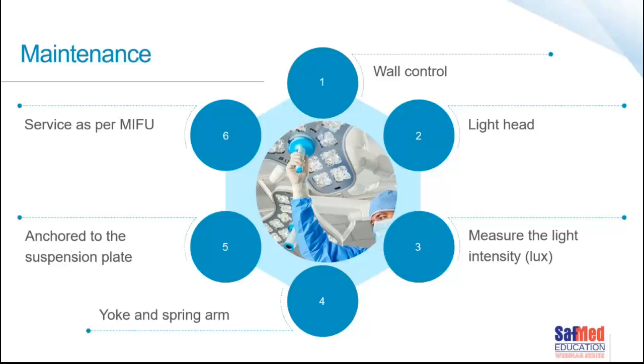So our technical department were chatting to me a little bit about maintenance and what they would do when they're servicing and managing and assessing and installing a surgical light. The wall control itself is important, that it's functioning properly, that you follow the instructions for use. Even one of the manuals was saying don't store things on top of the wall control, especially if somebody brought in some liquid of some sort, don't store it on top of the wall control.